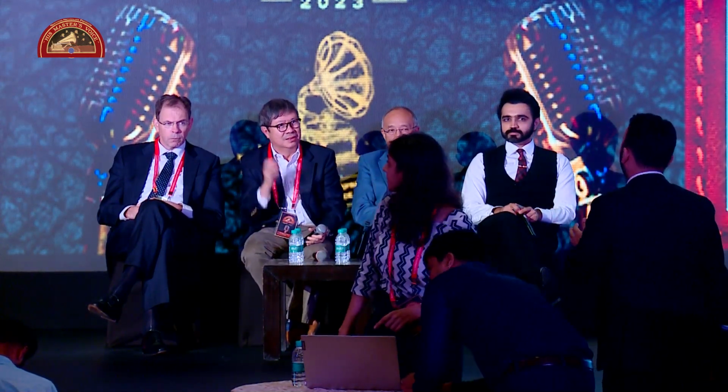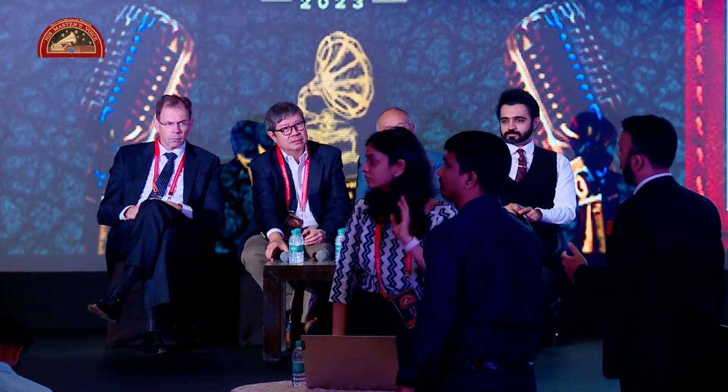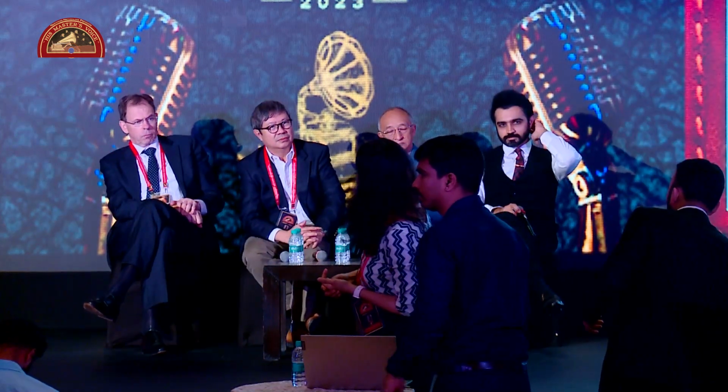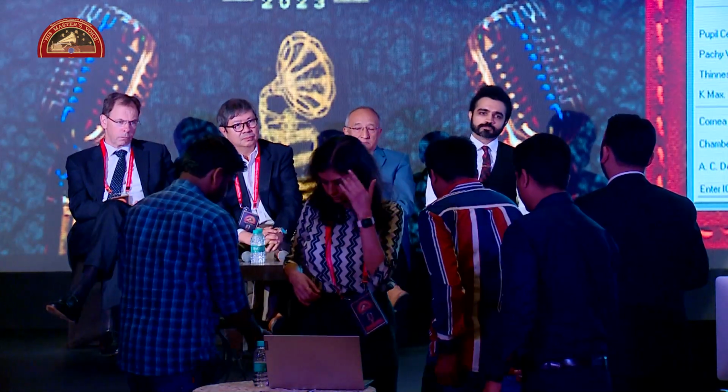That's really a nice question. What I would suggest is that when we do cataract surgery, we all optimize our result based on one particular instrument. So if my spherical outcomes are optimized based on my IOL Master, there are chances that if I take a different K value from another machine, I might miss out something there. Having said that, if somebody has optimized their outcome based on SIM K values from Pentacam, it's absolutely fine. So suddenly for one particular case, if I change my K values which I borrow from another machine, I don't feel very comfortable about that.